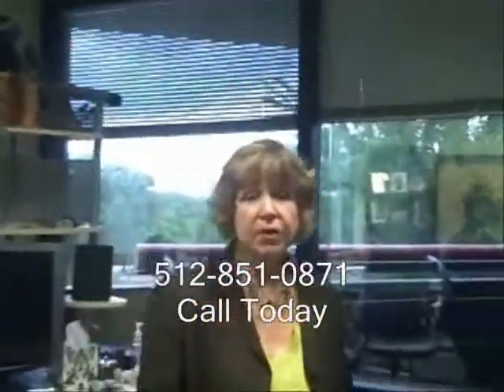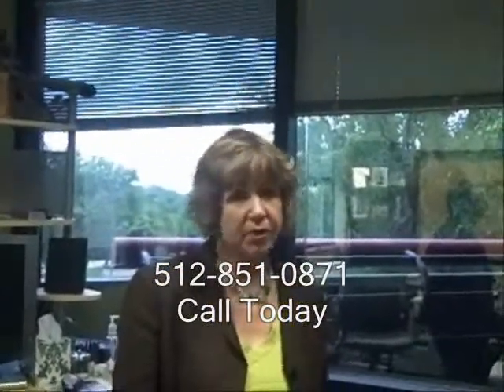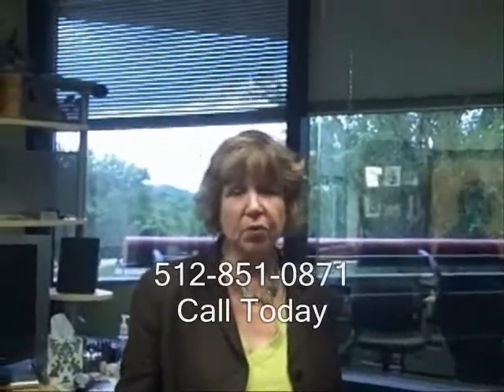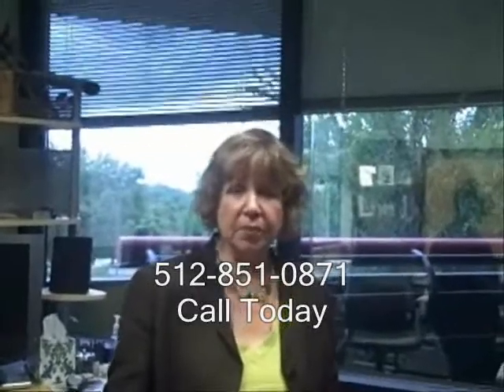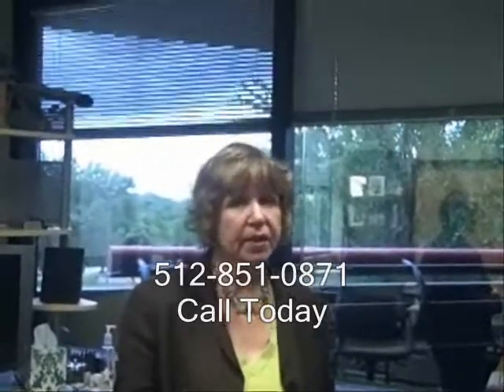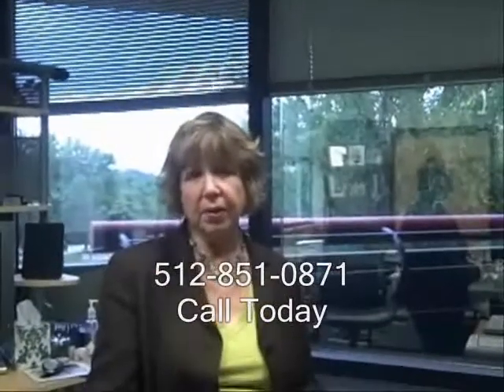Okay, the very first thing I do is I test you with speech, and I test with calibrated speech that's pre-recorded because it's very well controlled, and I can be as sure as possible that I can compare your responses to other people's responses. It's not biased by my accent or by the fact that I'm a woman. I want it to be very unbiased.